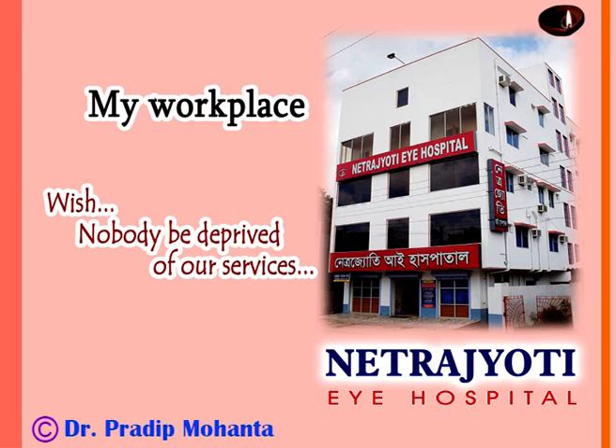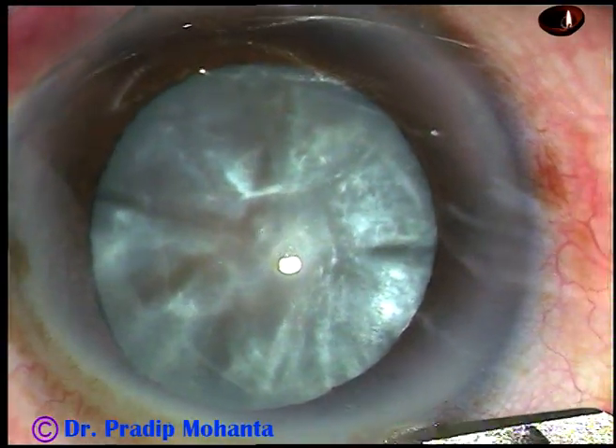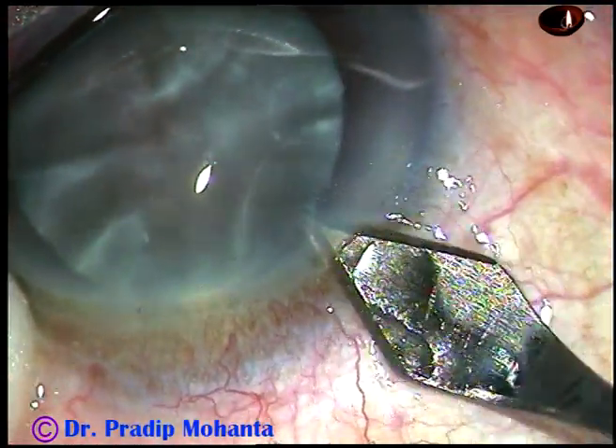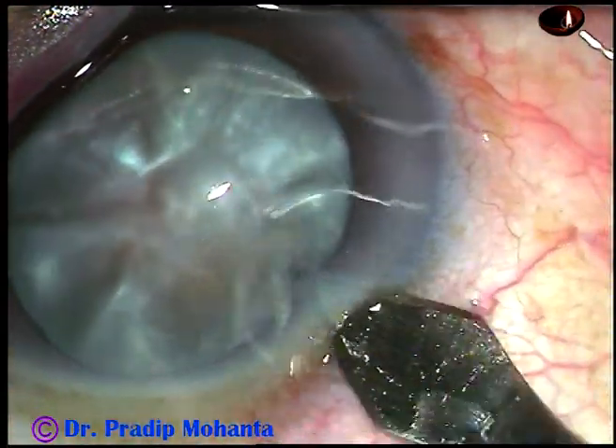Friends, welcome to my workplace at Ranaghat, West Bengal, India. This is a white intumescent cataract with a very hard nucleus. Let us see the management of this case.